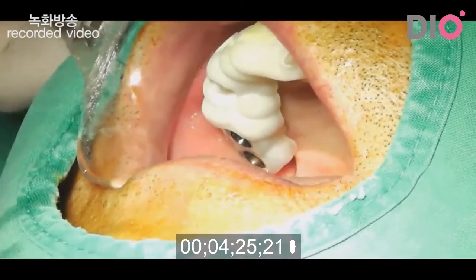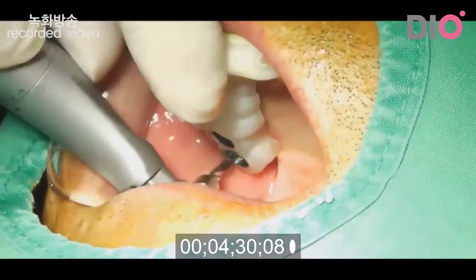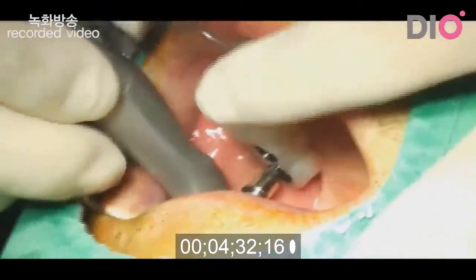Minus 1. Okay, I drill first in the second molar area.